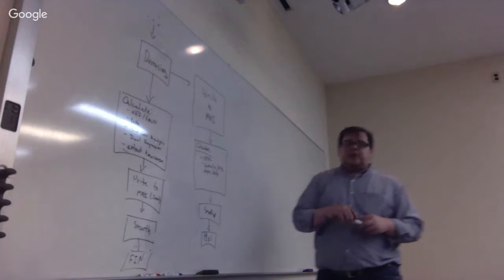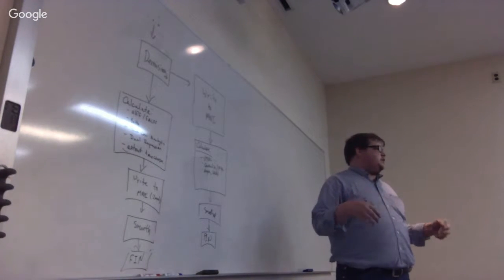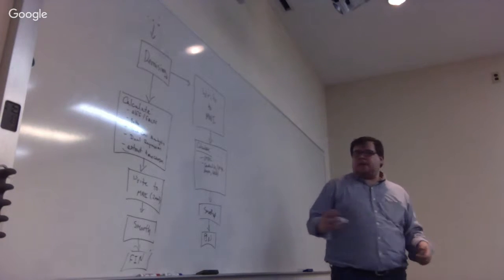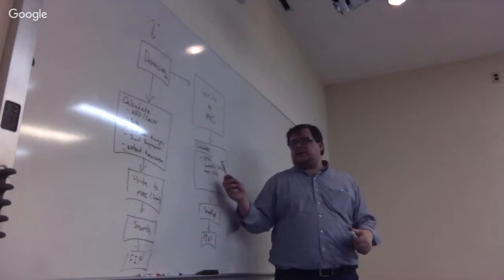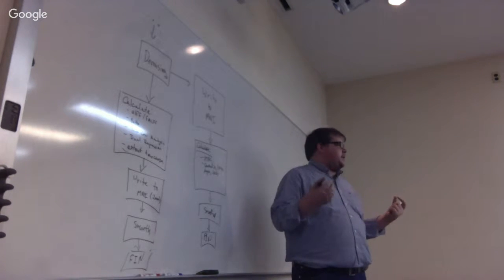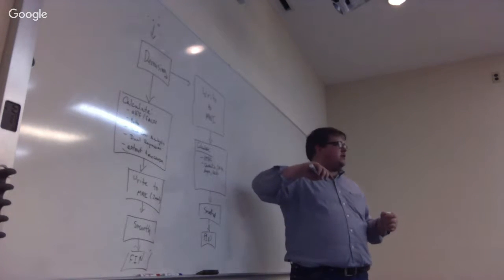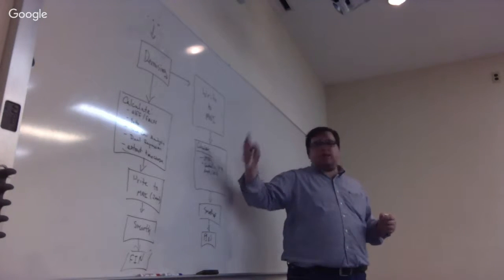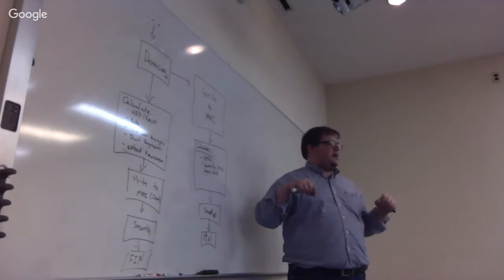Now, the reason why we do these this way is because their calculation pretty much requires it, right? So in order to do voxel-mirrored homotopic connectivity, and we'll go over that in a little more detail in a minute, we need the brain to be symmetric. So we'll calculate a separate registration to a symmetric brain, then write it into symmetric space, and then do the calculation in that space.